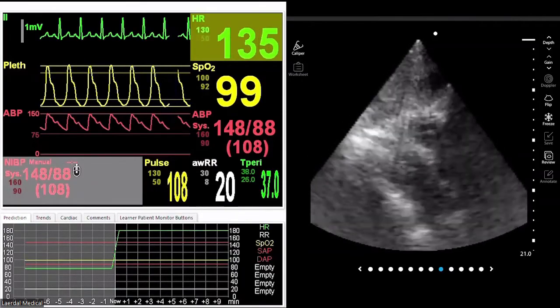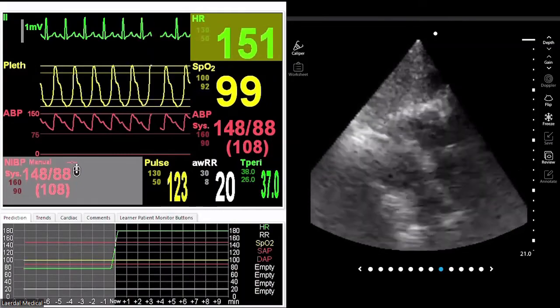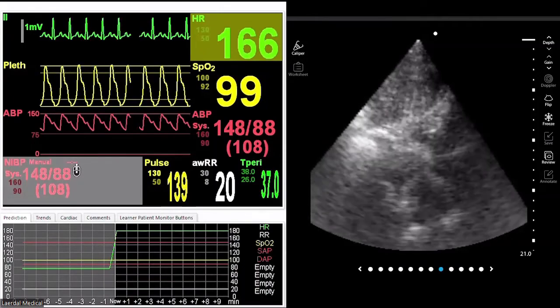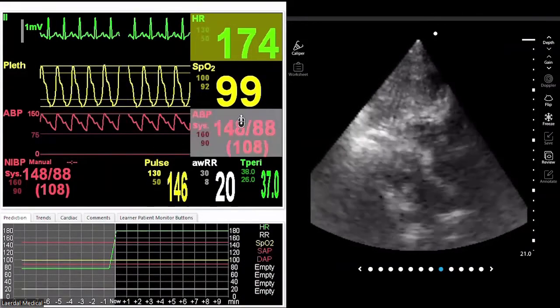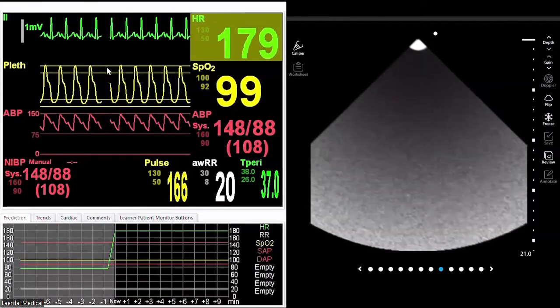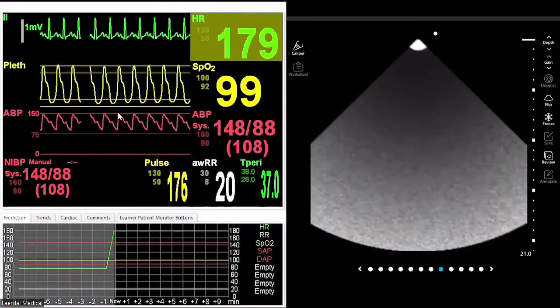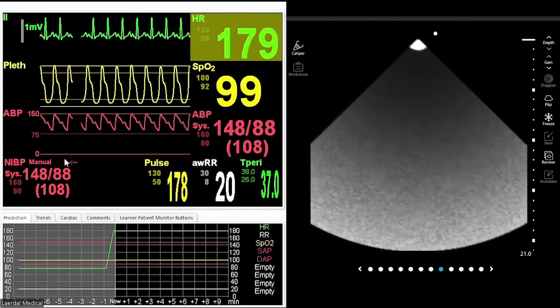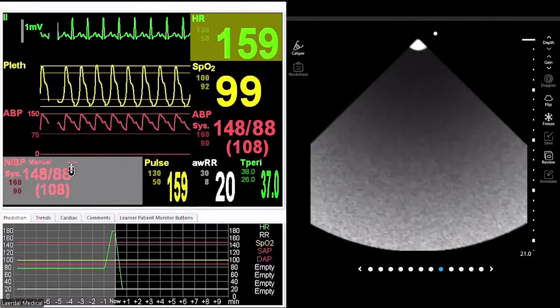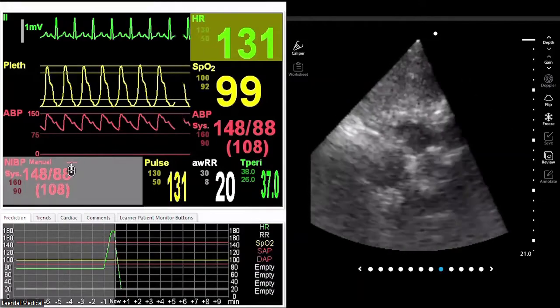You can see there that the heart rate's getting quite a lot faster now. That was going from 76 to 180. Let's now do another example where we slow the heart rate down. We'll click on the heart rate, and again slow it down to around 20 beats per minute. We'll set that to run over about 40 seconds and then select OK. Then if we acquire the image of the heart again, this time we'll see the image go from a fast heart rate down to the 20 that we have selected.